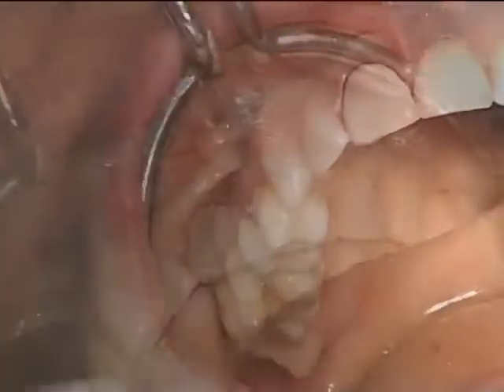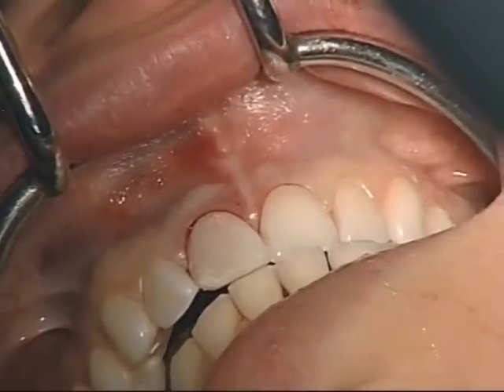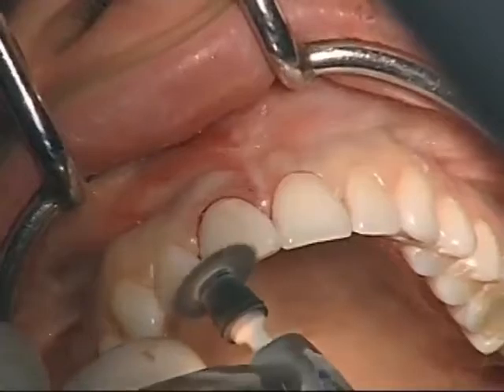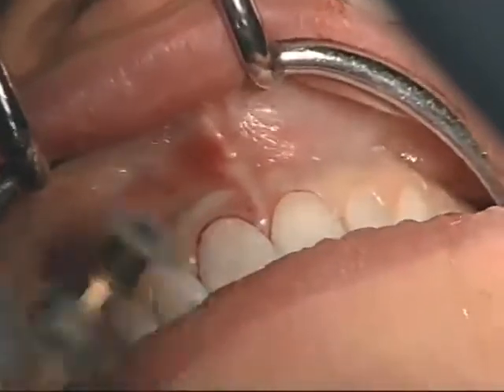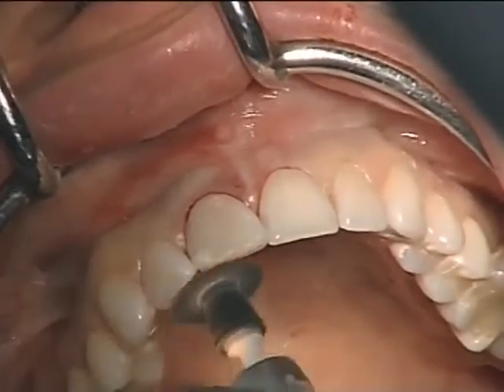Evaluation of protrusive relationships, free of contact in this region. Further manipulation to the incisal edge. And we're just doing some more recontouring of the facial aspect and emergence profile of this provisional abutment to aid in temporary aesthetics.